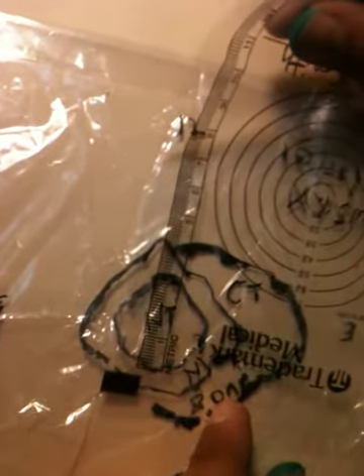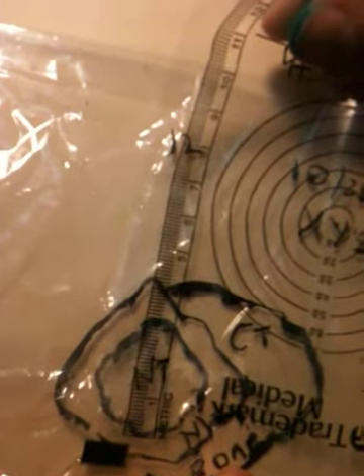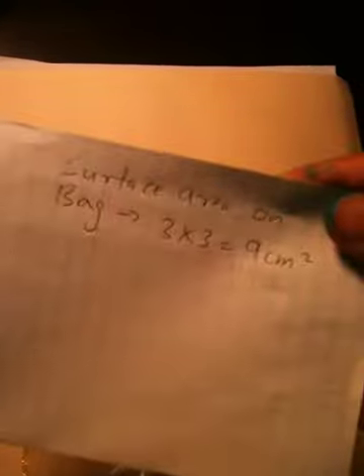If you see this, the longest width comes out to be nearly 3 centimeters, and the longest length is nearly 2.9 centimeters, or probably 3 centimeters, I guess. Yes, so the surface area was pre-calculated as 9 centimeters square.